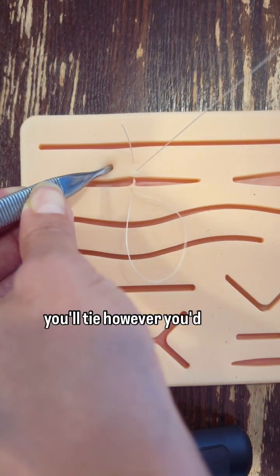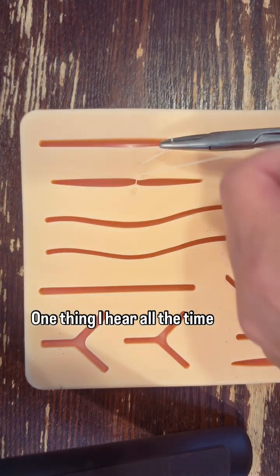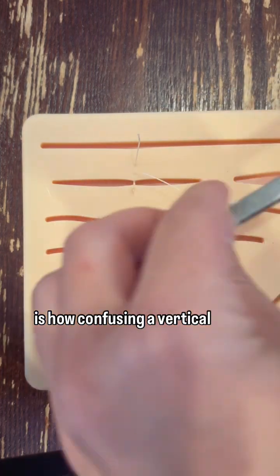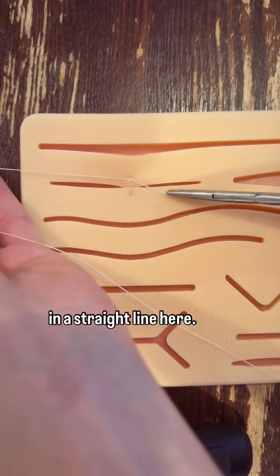Then you'll pull through and tie however you'd like. One thing I hear all the time is how confusing a vertical mattress versus horizontal mattress is. The vertical is in a straight line here, so you can see how nice that comes together.